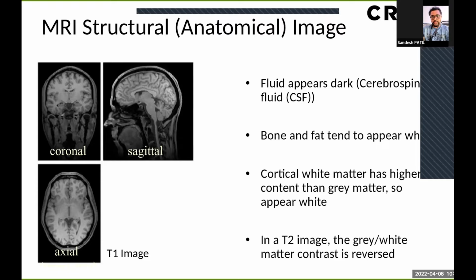If you look more closely at the image, you can clearly distinguish between the actual brain and the skull that surrounds the brain. The dark layer between the brain and the skull is called cerebrospinal fluid, or CSF. Its work is basically to cushion the brain and the spinal cord from injury, and it also serves as nutrient delivery and waste removal for the brain.